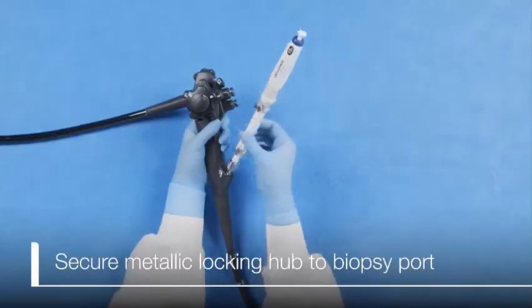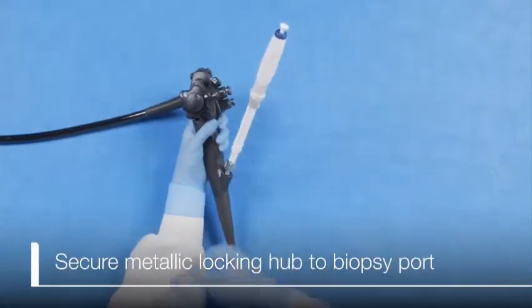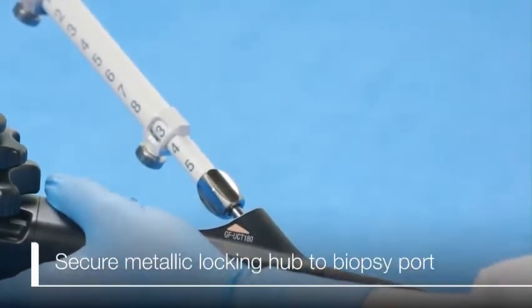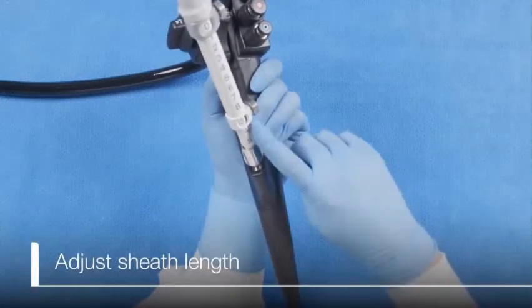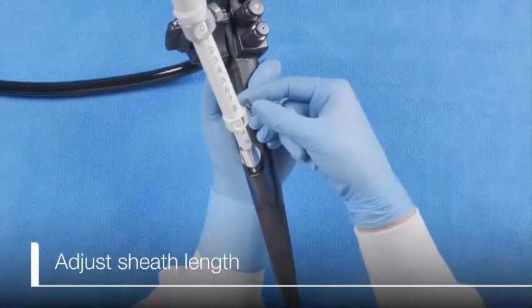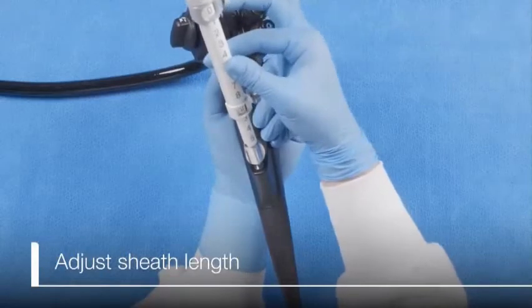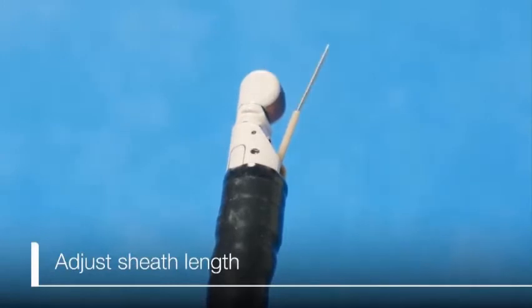Before deployment of the needle, fully turn the locking hub to secure it to the biopsy port of the scope. The length of the sheath extended from the scope can be adjusted by moving the sheath knob. It is recommended that the sheath be visible in the endoscopic view to ensure that the needle will not damage the scope when it is deployed.